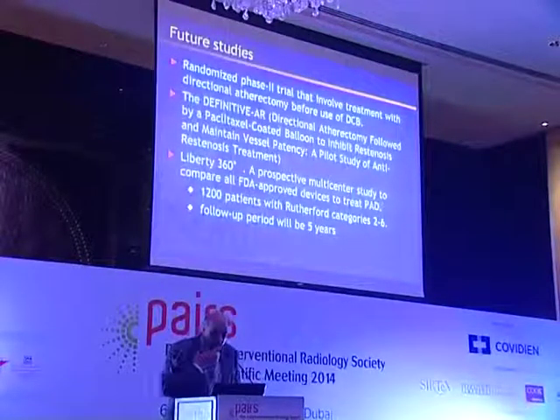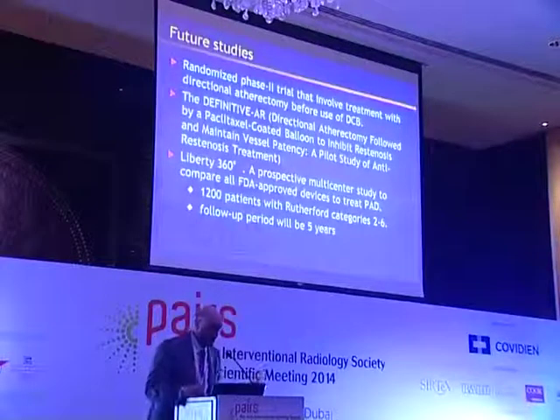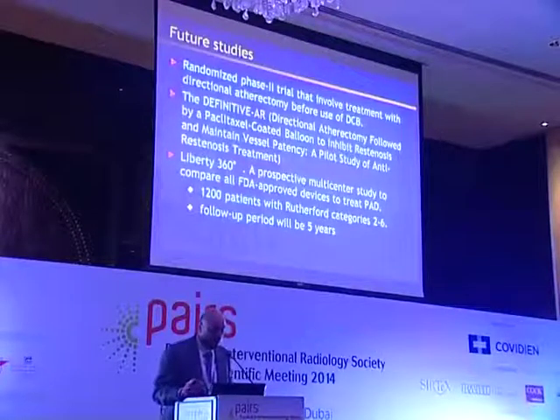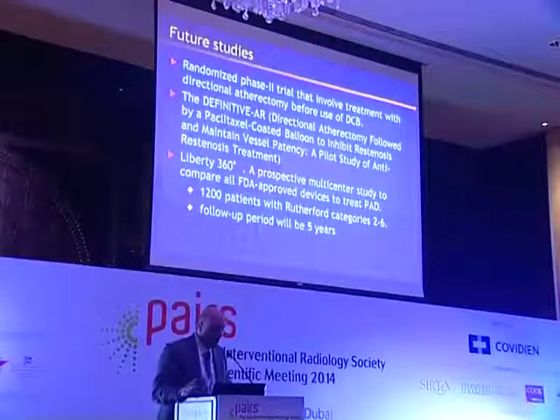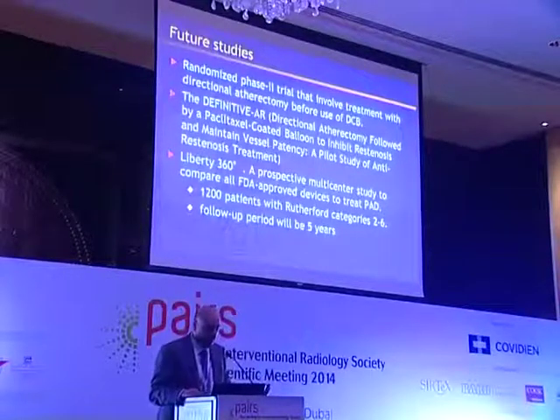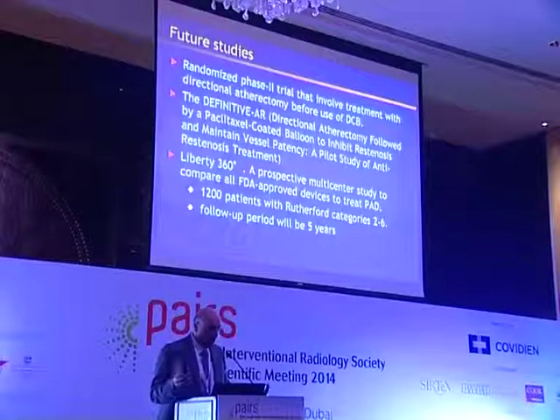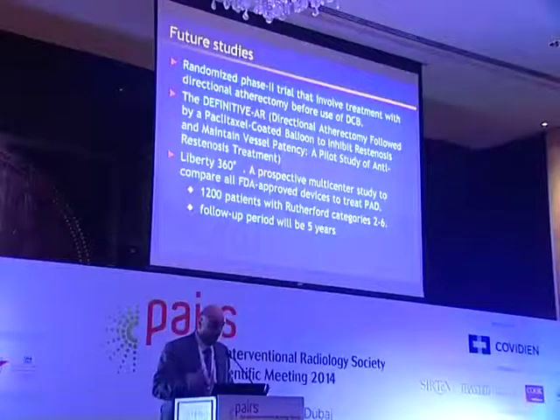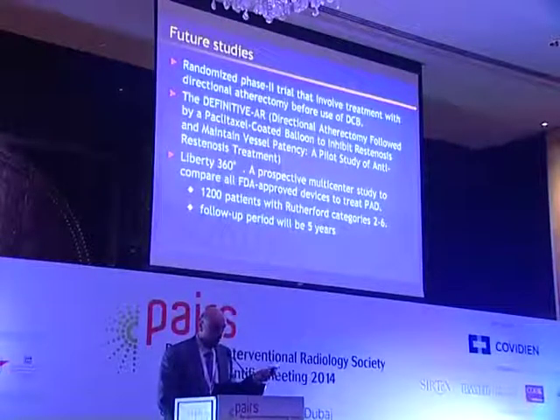Future studies: you heard a lot about drug-eluting balloons, and everyone is excited about them. Now we try to combine these different modalities. So the DEFINITIVE AR is directional atherectomy followed by a paclitaxel-coated balloon. It's a pilot study for femoral stenosis. This is something we're looking forward to. And also, to compare all these different devices, there's the LIBERTY 360 trial, where all FDA-approved devices need to be looked at, compared, and followed up for 5 years. It's going to be a long trial. They're going to have multiple centers involved, and hopefully we'll have some results.